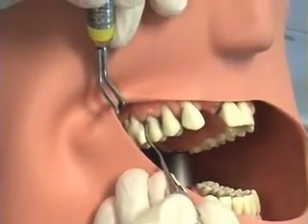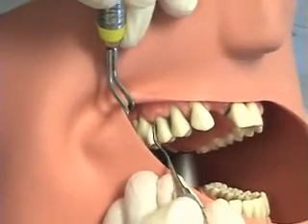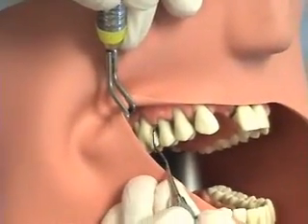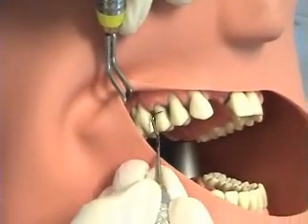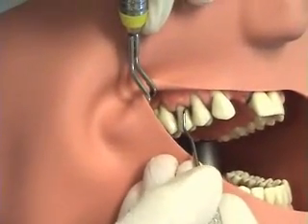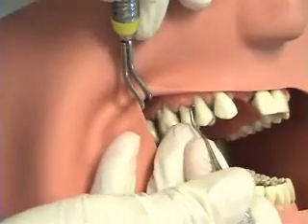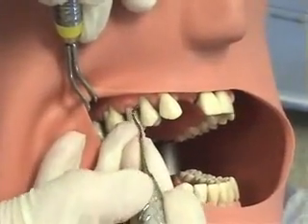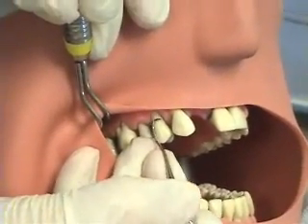This instrument is used for supragingival calculus, again in a short pulled stroke, working from the distal line angle to the distal, and the distal line angle into the mesial. The use of this modified sickle in the posterior has somewhat been replaced by ultrasonic instruments.